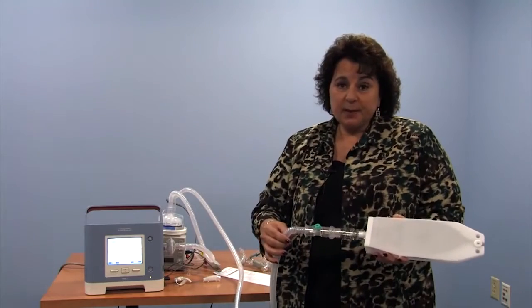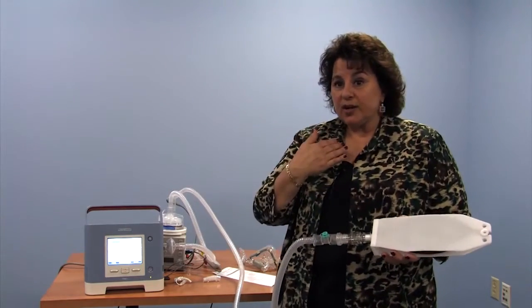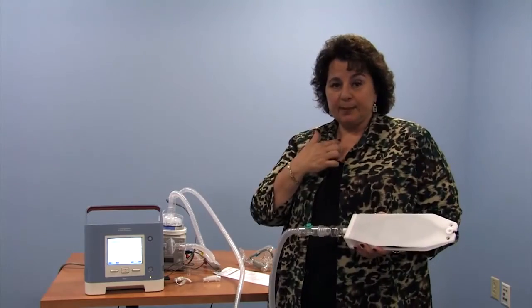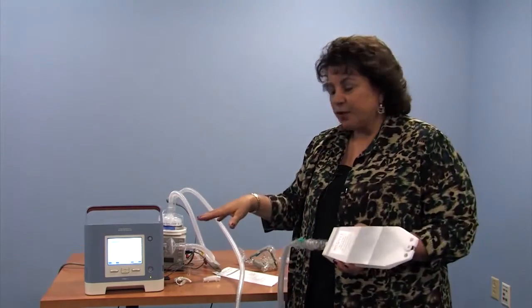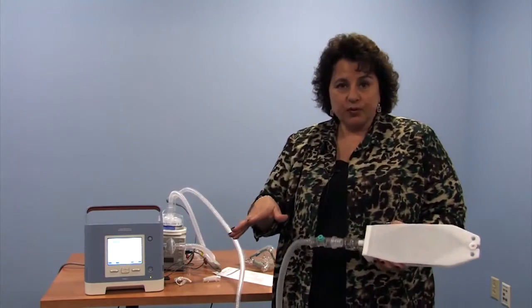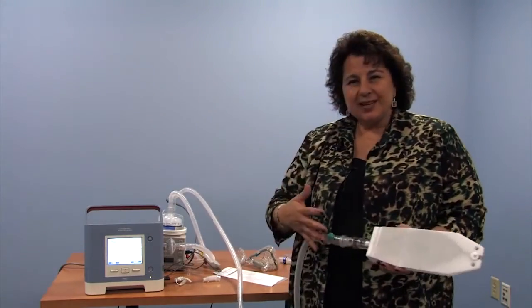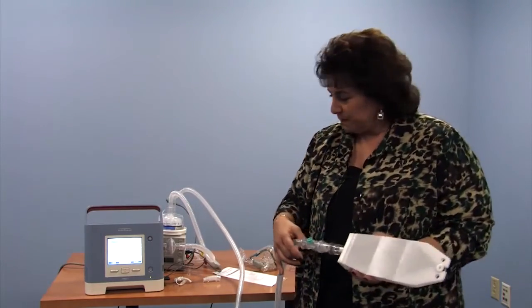We have some families, some children who maybe are on a tracheostomy tube now, but they're doing better and thinking about going to BiPAP with a mask and getting the trach out. So we cap the tracheostomy tube and put the mask on their face. The machine is versatile in that it can do many different things for the children. It's helpful sometimes to have the family learn this, and then when they go to BiPAP, they already know the machine. Although there will be some changes, it won't be something very new to the home.